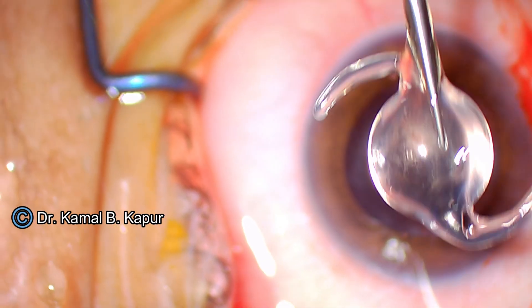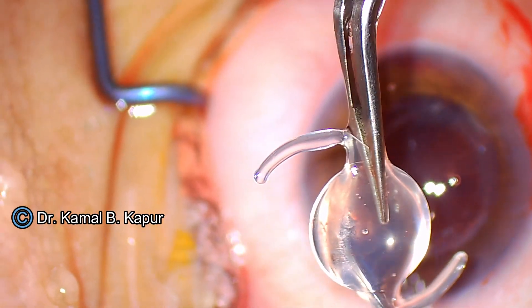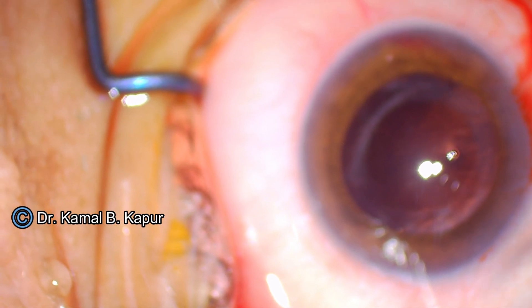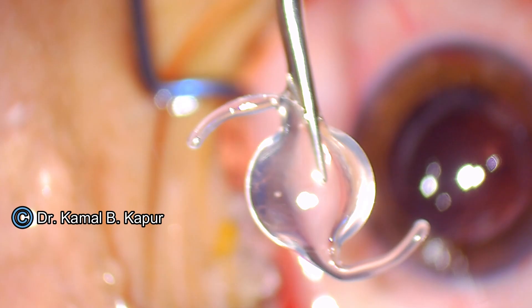When you are pulling, make sure that you hold the optic of the lens and pull out. If the wound is tighter and you pull by the haptic, you can end up breaking the haptic, leaving a sharp edge at the haptic-optic junction, which could cause damage to the endothelium or even the posterior capsule. And there you see the opacified IOL is out.